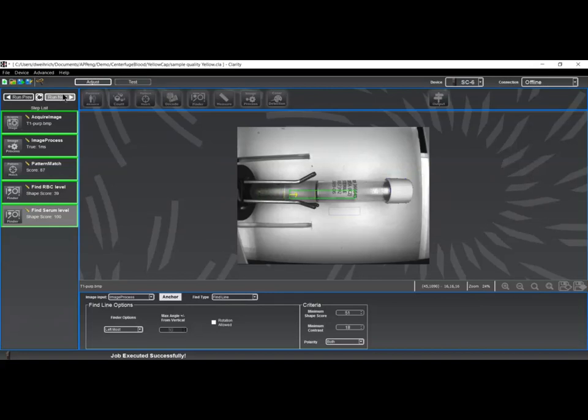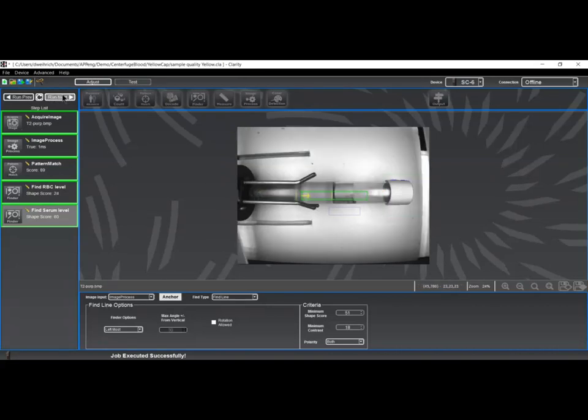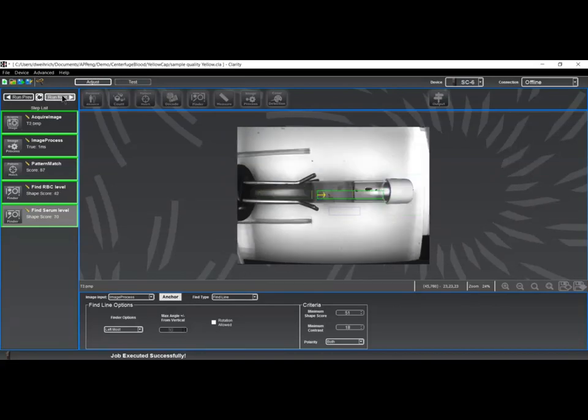One more feature of this step is that I have anchored this process to the previous process of finding the RBC level. This makes the most sense since the serum level will be above the RBC level. From that anchor point of the RBC level, which is here, I've moved my region of interest a little above that, and I'm looking again for the leftmost transition. Again, you roll through the different samples to make sure that the criteria that I've listed operate well and are valid for most of my extreme variation of cases.